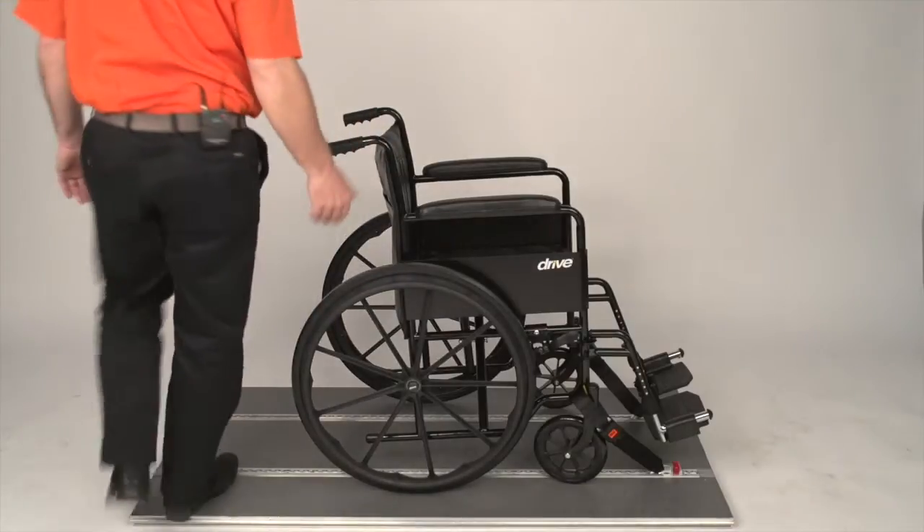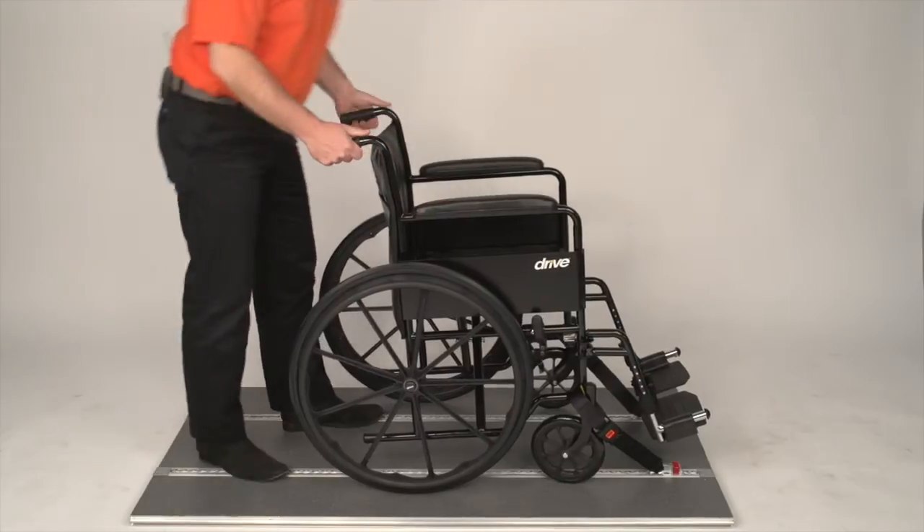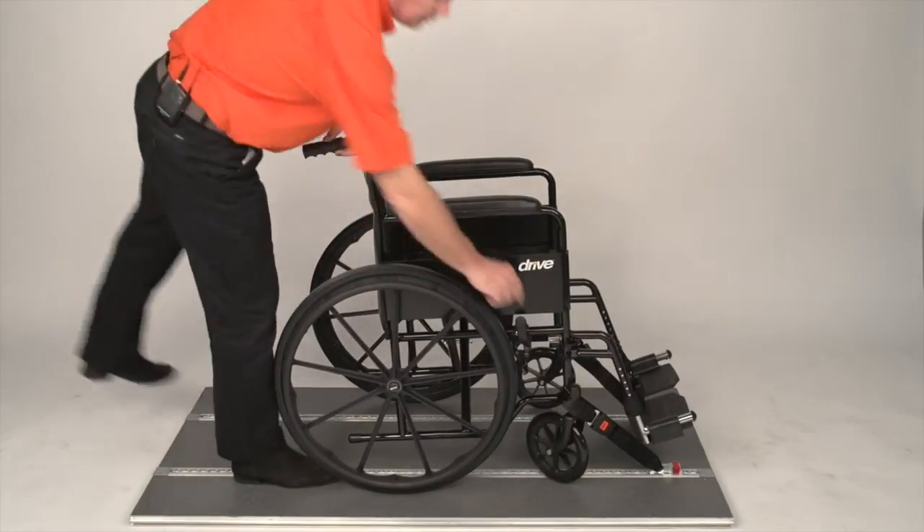We come to the rear of the wheelchair, release the brakes, pull the wheelchair back towards you, then put the brakes back on.